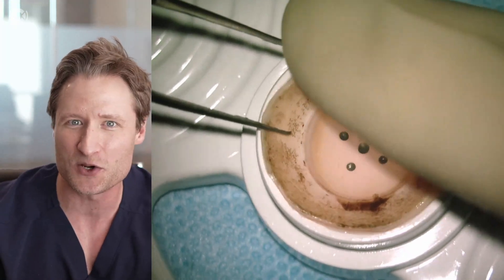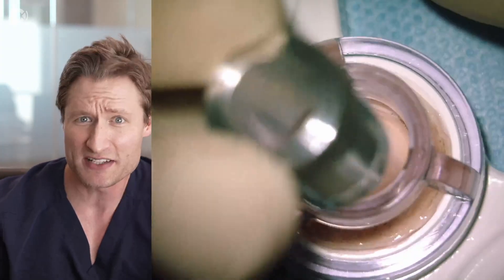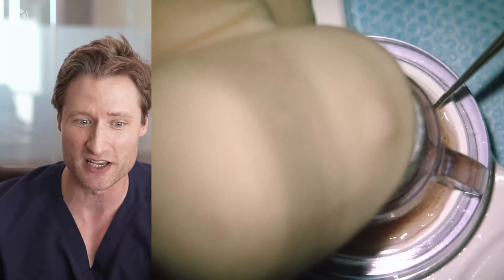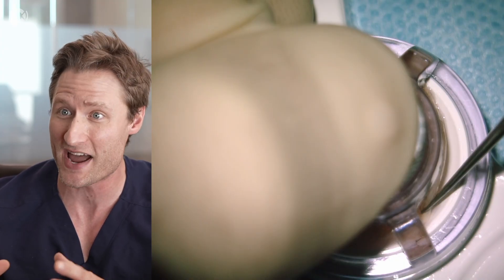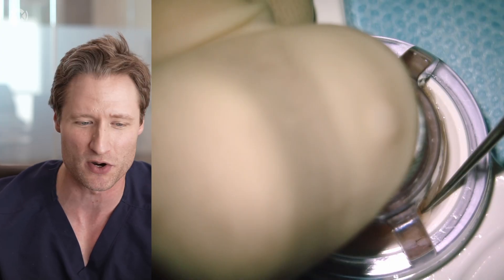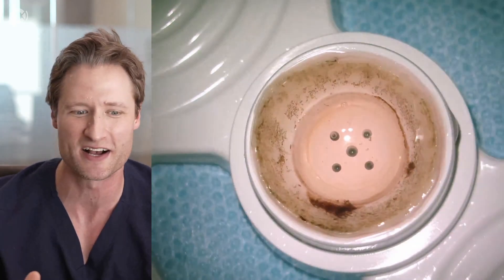This is me operating yesterday. We've removed this corneoscleral rim from its storage solution that it was delivered to us from the eye bank. I'm putting it in this little coronet trephine and I'm trephinating it to a size that I typically use — about nine millimeters. I like using nine millimeters because conventionally for these keratoprosthesis devices, the back plate is 8.75 millimeters, so you need a donor corneal button that's at least as big as the back plate. I've just punched the center of the cornea from the corneoscleral rim and I'm spinning it to verify there are no lingering connections between the cornea and the scleral rim.